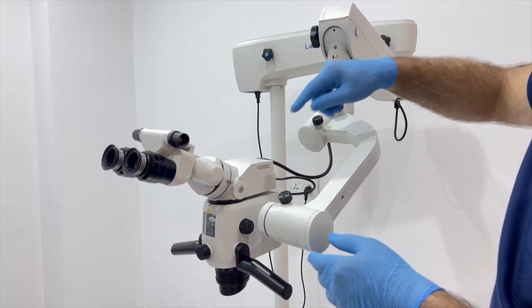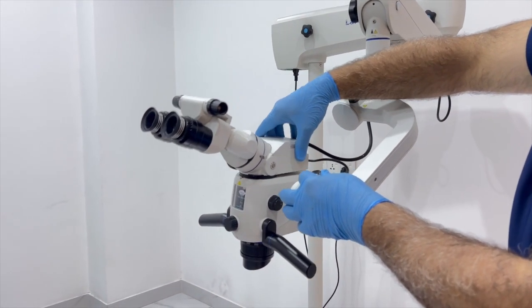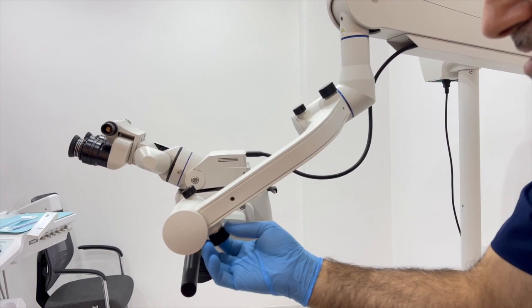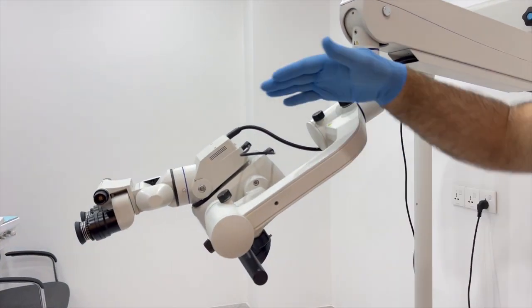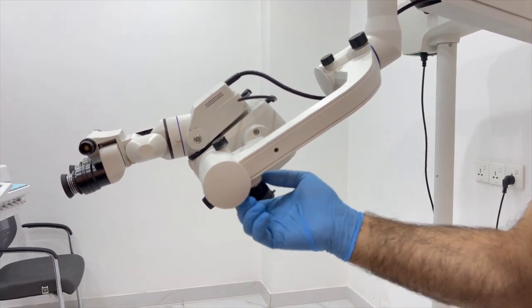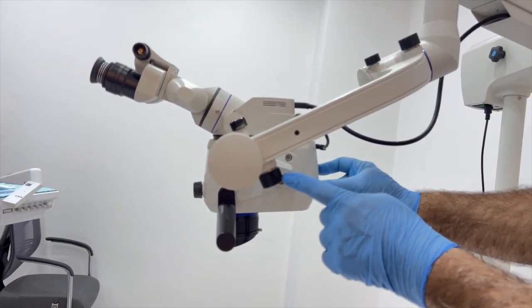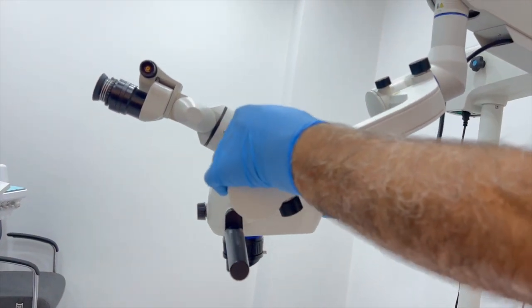And the screw which is responsible for the anterior and posterior is this screw. So by tightening anti-clockwise, for example, the head of the microscope will tilt anteriorly. In a clockwise direction, the head is tilted posteriorly. Okay, so this is responsible for the balancing of the anterior and posterior rotation of the head of the microscope.